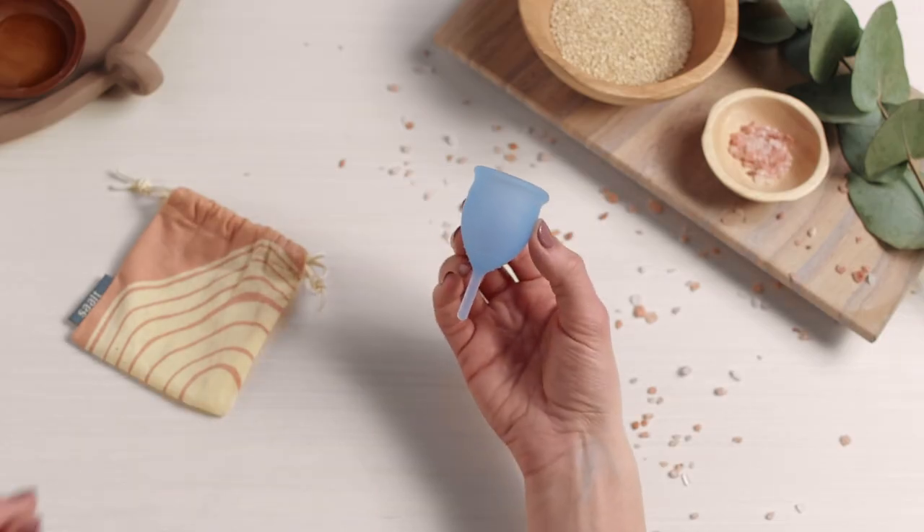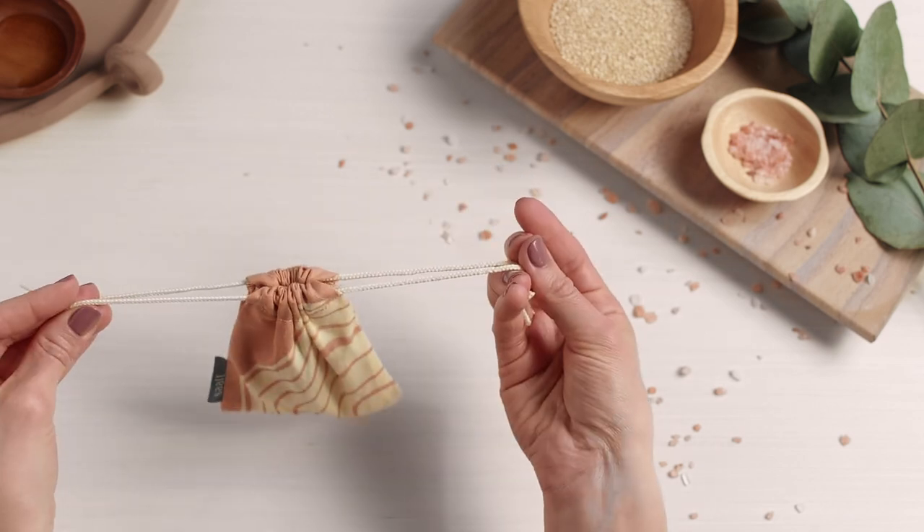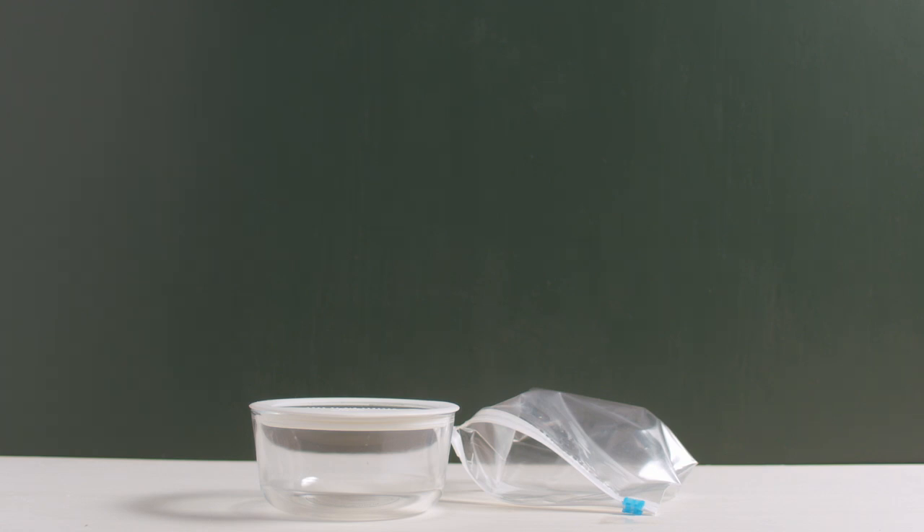After you've cleaned your cup and let it dry, you can store it in your salt bag or another breathable fabric bag. Never use a plastic bag or an airtight container for storage.